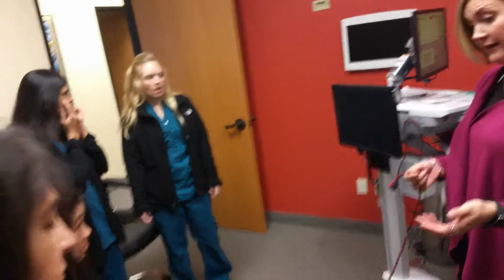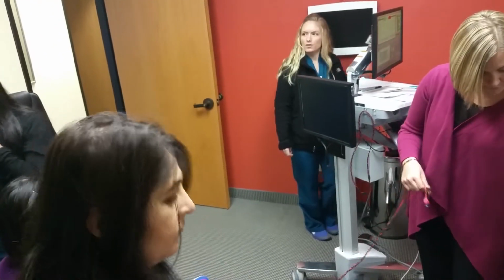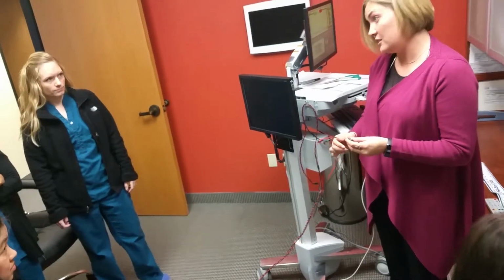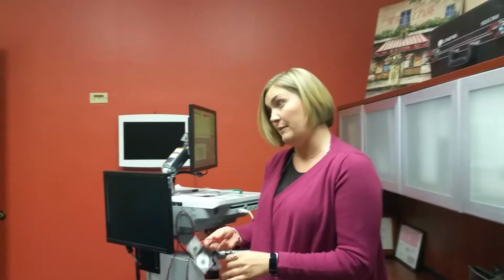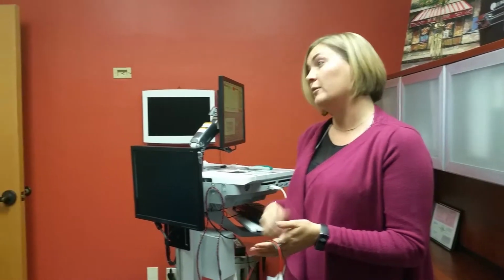It's also very important that you guys find out what prescription your patient's wearing. I know with retina practices it's kind of hard because you all don't really do any refractions or anything like that. But keep in mind that whenever we're testing our patient, whenever they're looking at the screen itself, it's not the checkers that are stimulating them, it's the edges between the checkerboard pattern. So if for some reason their vision is very blurry and they can't see because they don't have the right prescription, then their test results are going to be kind of off kilter. It can be so much of a difference that it can cause a normal healthy patient to look completely abnormal if you guys aren't correcting them right. So make sure that you guys find out what your patient is wearing before you're testing them.